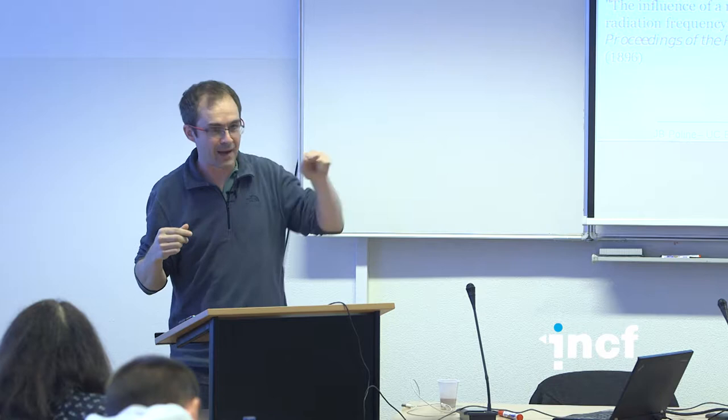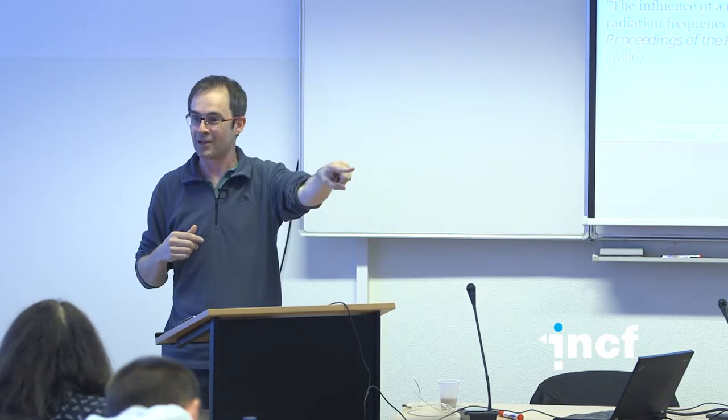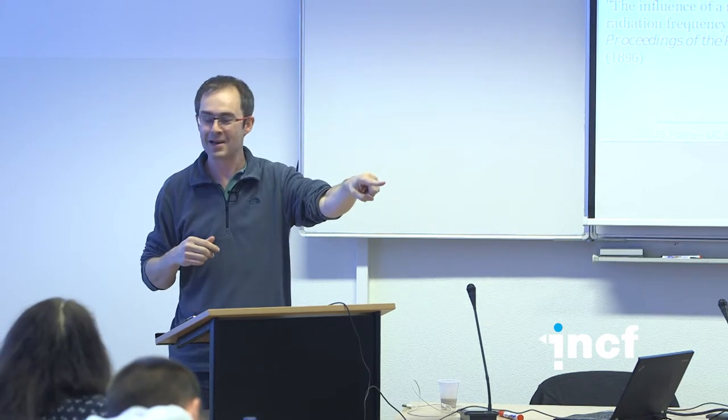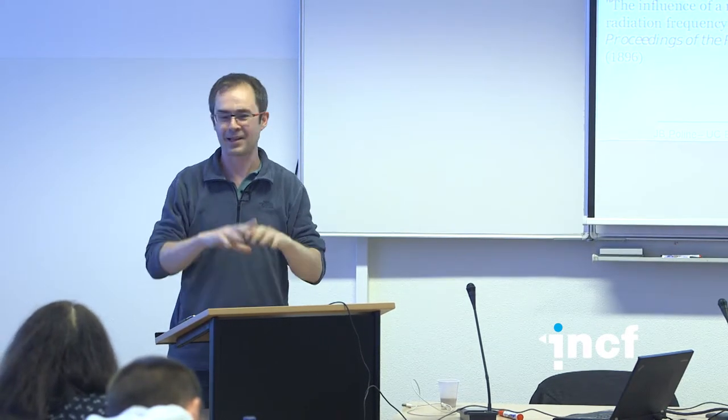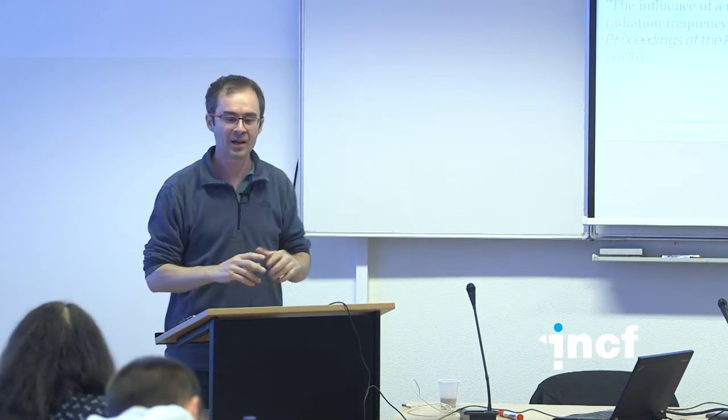We have another axis, which is x. Let's say this is x, then you have another axis, which is y. So you have to do gradients on the other axis as well. And there are a lot of tricks, and it's a fascinating area.